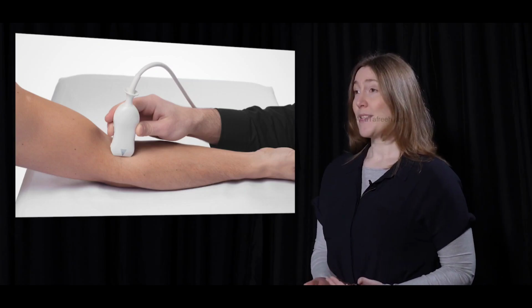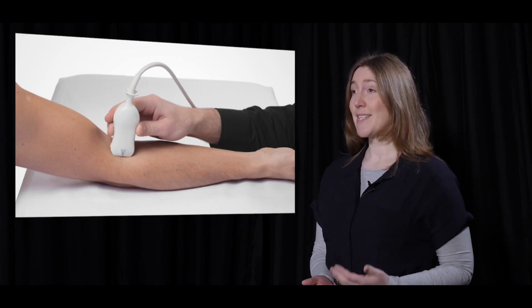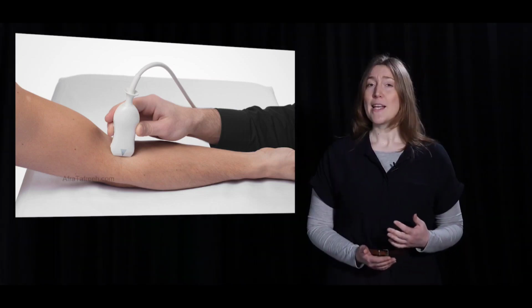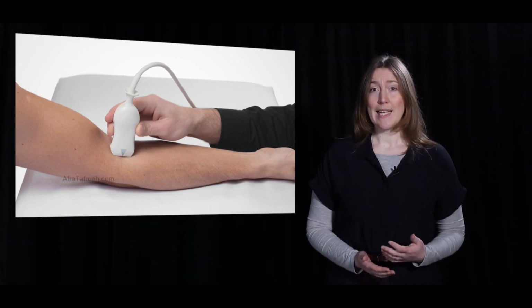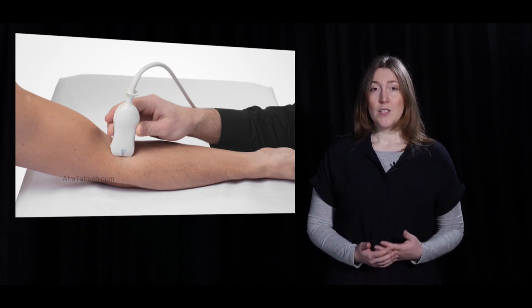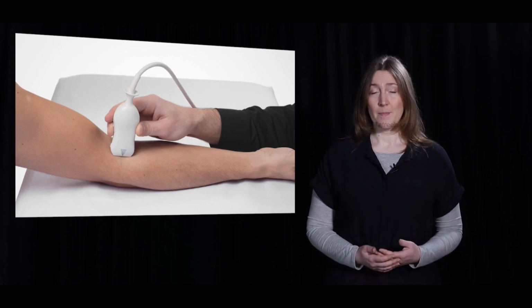With regard to scanning bursae and capsules, it's extremely important that the transducer pressure on the skin of the patient is minimised. Applying too much pressure with the transducer can lead to failing to visualise the fluid collection. Due to the pressure, the capsule and bursa are being squeezed and no fluid will be seen.